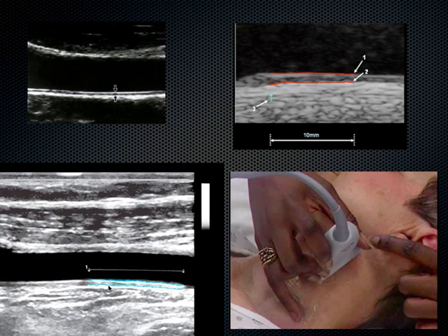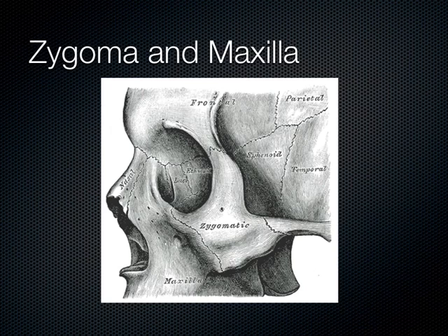But if you took it to a patient who was much older or had a lot of known coronary heart disease, you could see this thicken out quite a bit, actually. So something to think about, this carotid artery measurement stuff. Here we are with the transducer in a longitudinal plane. Now, what we're going to do is move on and talk about some of the bones. We did a lot of musculoskeletal last week, but we're going to remember some of those techniques and bring it to the face.